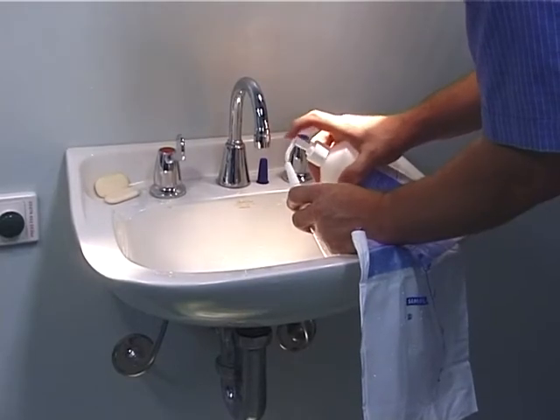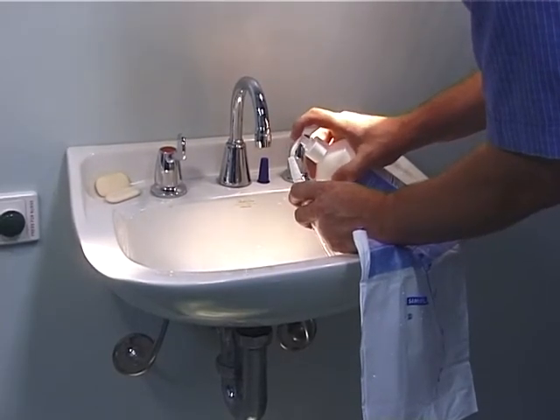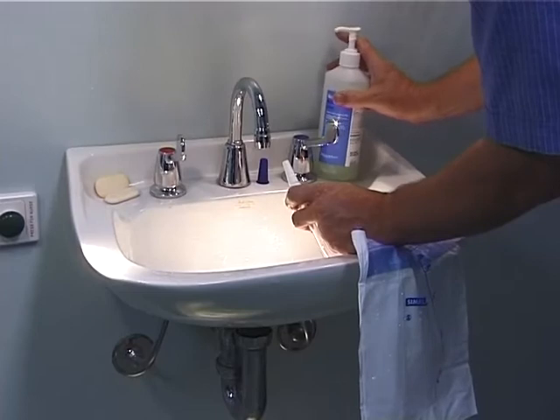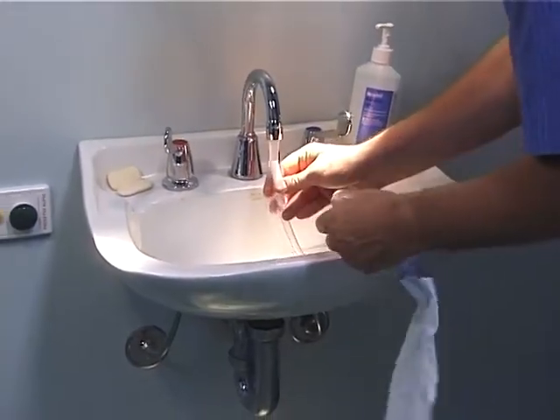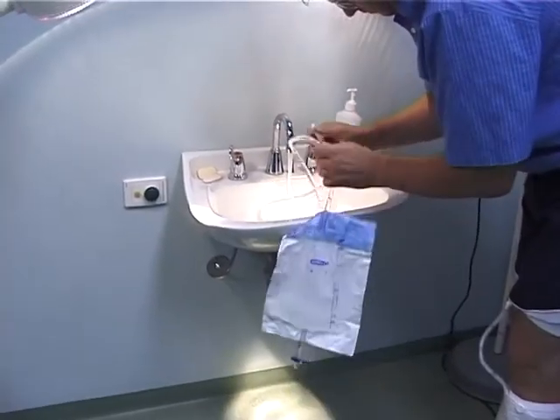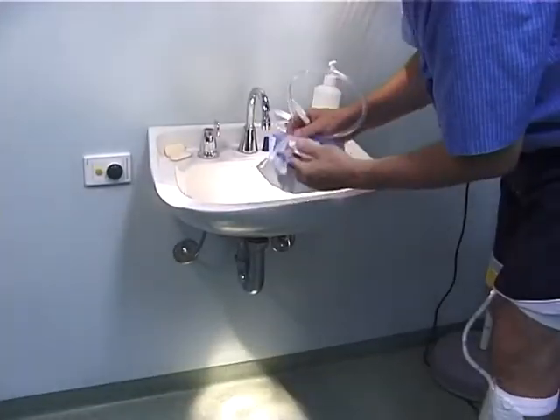Then squirt some liquid soap or detergent through the middle of the tubing and again quarter fill the bag, this time with warm water. And again shake the bag.